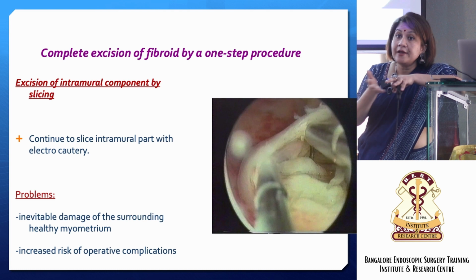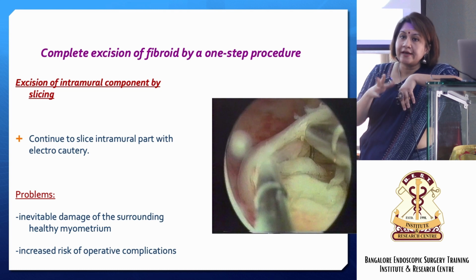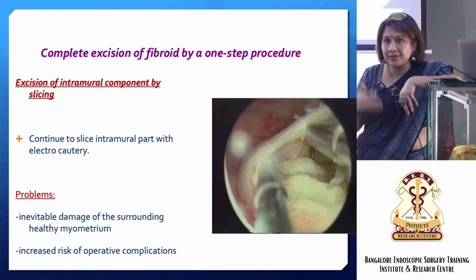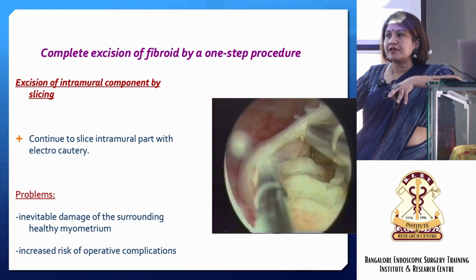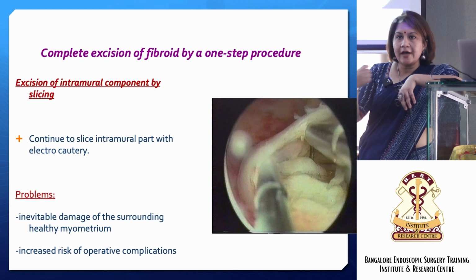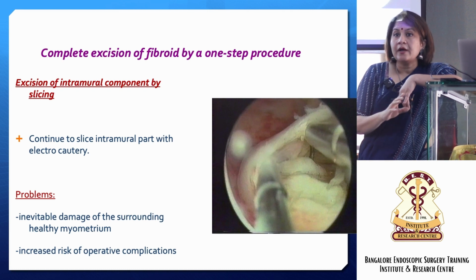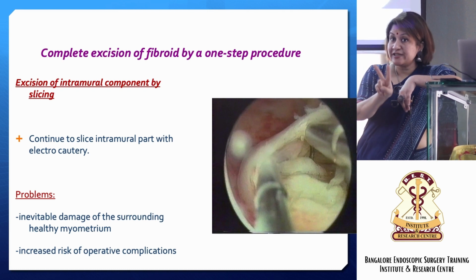Some people have done bimanual massage also. These are techniques that have been described, but they are obviously not very standard techniques. We don't have large data on these things. So one is called hydromassage, going in and out. Second is bimanual. Third is pharmacological. These are things that people have tried. Otherwise, it is okay to do it in 2 settings.